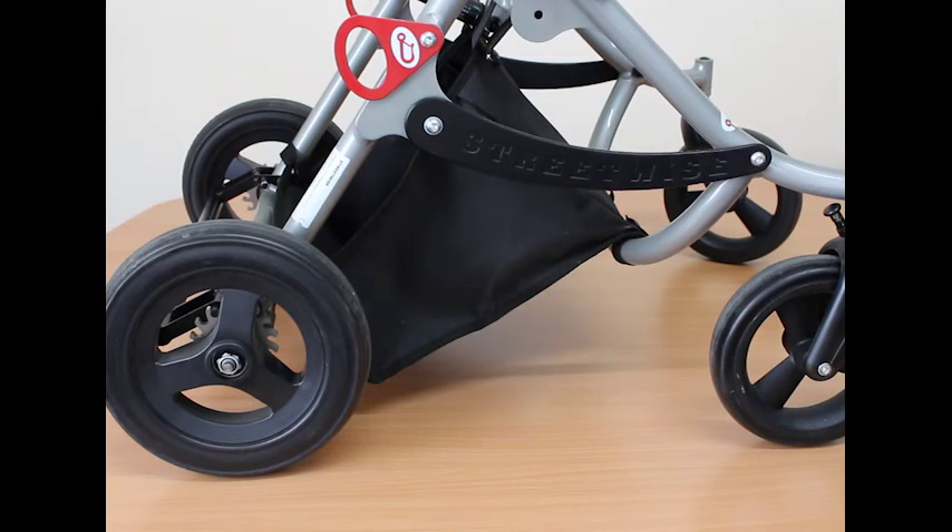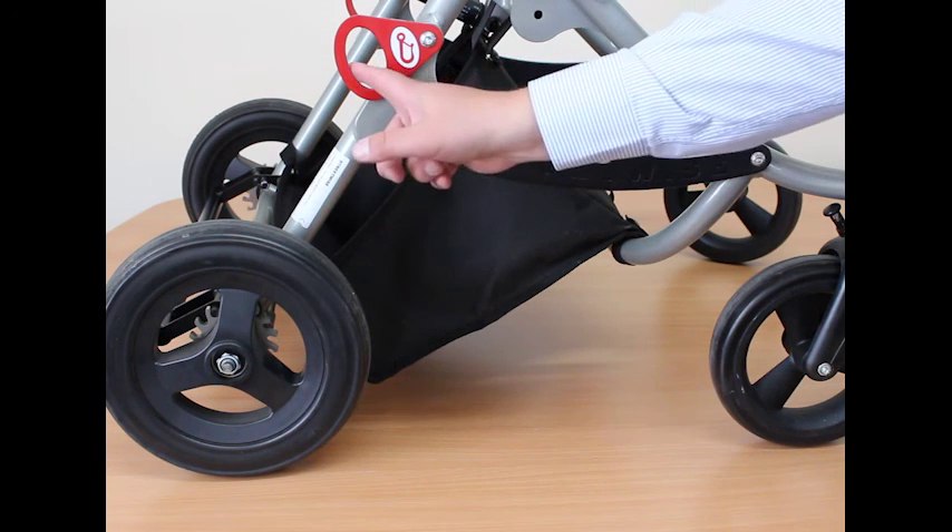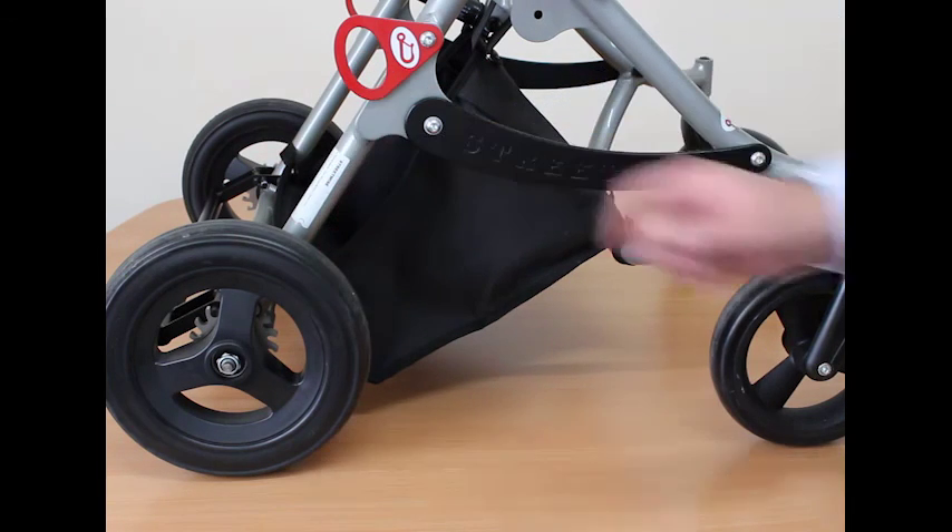The Streetwise Buggy is crash tested. Restraints should be fitted first to the front around the tube where the label is, tied down to the floor. Then the rear tie-downs are fitted to the bracket at the rear, tied back down to the floor.